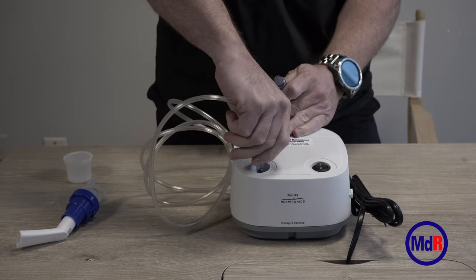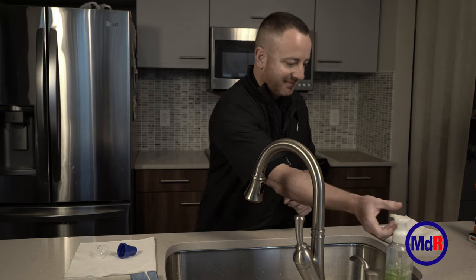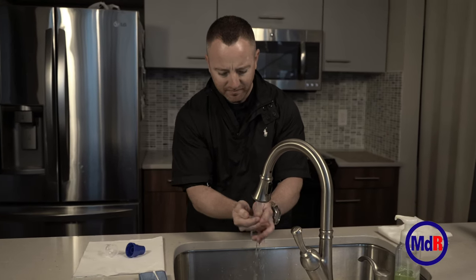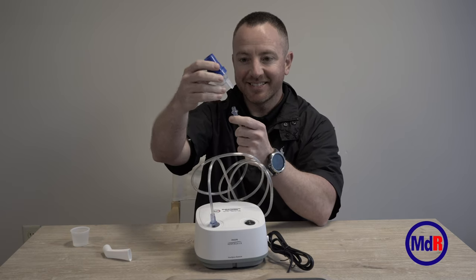After each treatment, make sure you unhook the tubing from the machine. If you leave it connected, it could melt to the machine or it could break it.